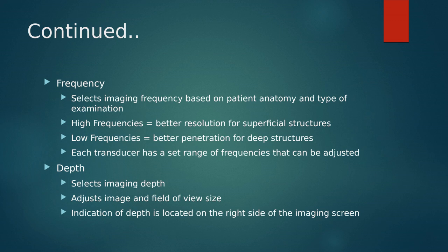So a lower frequency is going to be that marathon. It's traveling a little bit slower, but it's better for us to look deeper into the body because that sound wave is still going to have energy left over to continue traveling. High frequencies, that's the sprint. That's going to be when we're looking at something that's very close to the surface of the transducer, very superficial structures that are located very anteriorly in the body, and we're using a sound wave that's typically traveling a little bit faster in those scenarios.